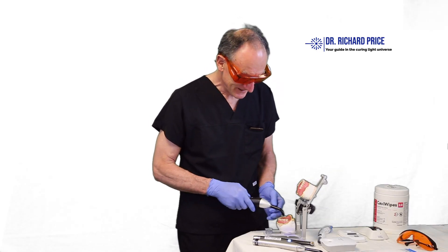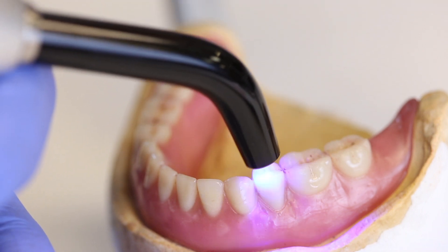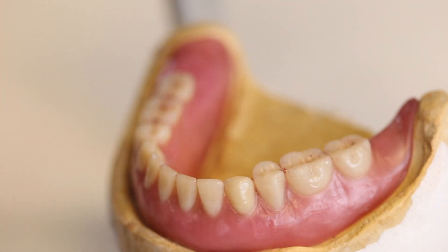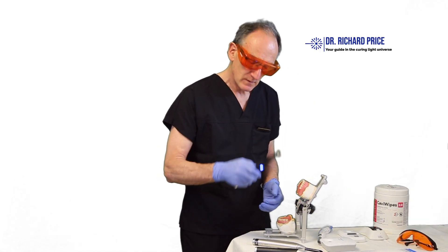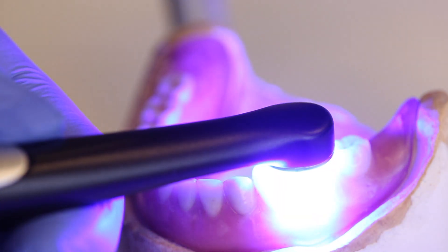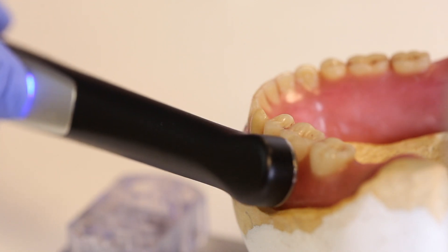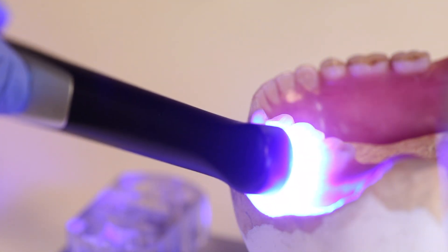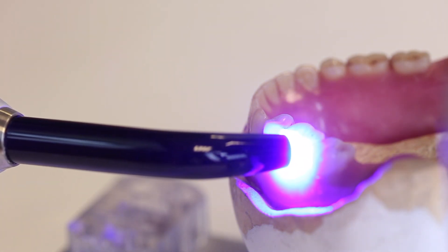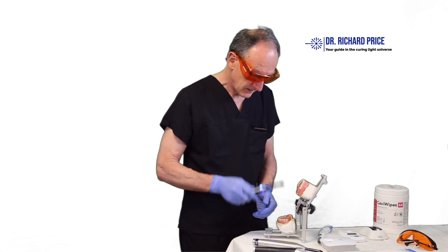In contrast, a light with a small tip only covers a small part of the restoration, meaning you may need to cure once on the mesial, once in the middle, and once on the distal box. A light with a bigger head can cure the entire tooth in one shot. However, a big head isn't always ideal — for a small Class 5 restoration, a smaller head is better so you can position it precisely without curing the gums. For large restorations, a big head is better.